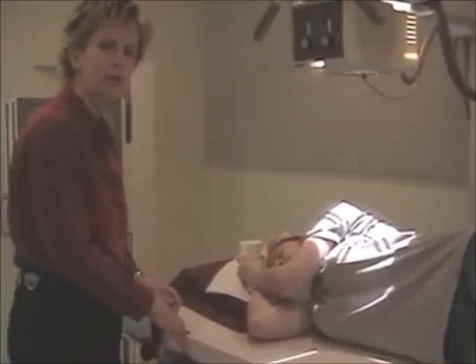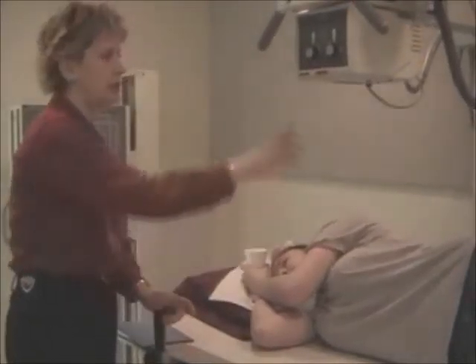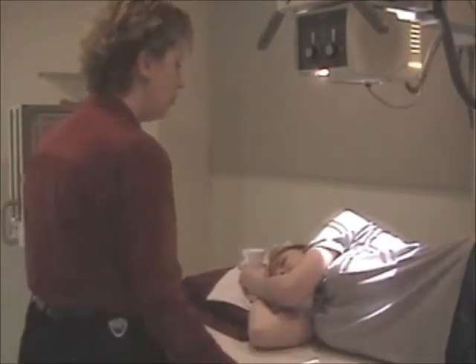Where is the esophagus? Where is the esophagus in relationship to the spine? It's just anterior to the spine. So we're going to slide the tabletop towards me. And I'm going to look at the patient's body, and there's their spine. That would be the mid-axillary line. You know that from your thoracic vertebrae and your lumbar spine vertebrae exposures. And then the esophagus is just anterior to the spine. And I can also look at the patient's neck, that trick that I talked to you before, and make that crosshair come right down there. Okay? And the instructions to the patient would be the same.